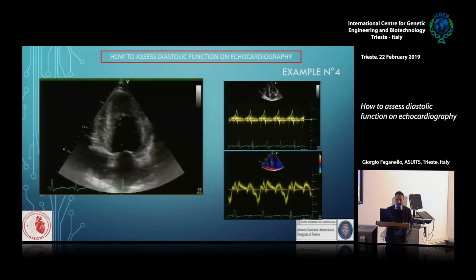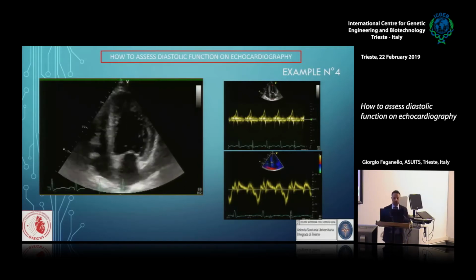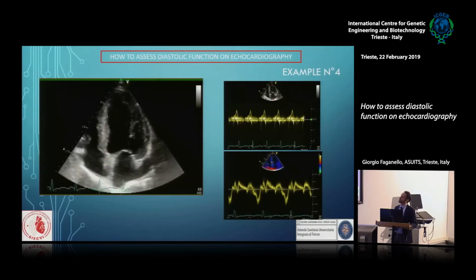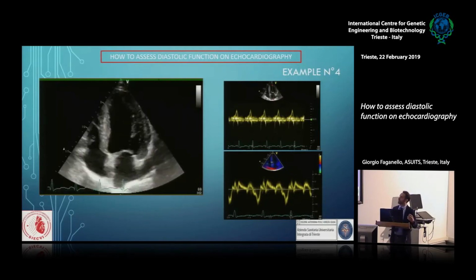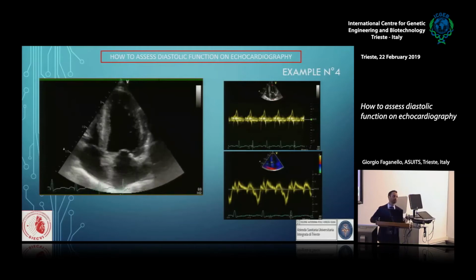So, a 55 year old with a history of ischemic cardiomyopathy, he's had bypass, and very high blood pressure. His left ventricle is very heavily hypertrophied. Okay. There's a heavy hypertrophy on the left ventricle, which is quite dilated.